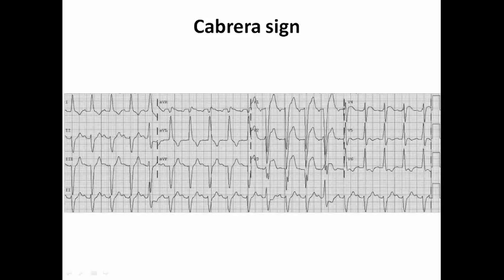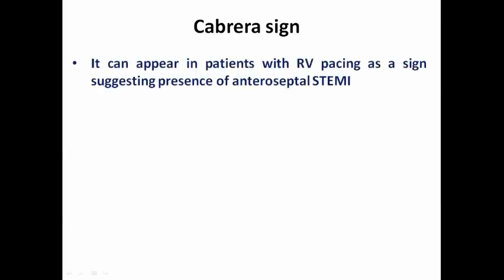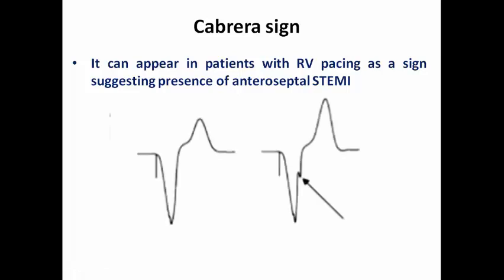Here as well we can see the Cabrera sign — notching in the upslope of the S wave in V2 and V3 — suggestive of ongoing myocardial infarction. It can also appear in patients with RV pacing as a sign suggesting anteroseptal STEMI. So when you see a notch in the upslope of the S wave in a patient with a pacemaker presenting with typical chest pain, I would consider this patient as STEMI and arrange coronary angiography.